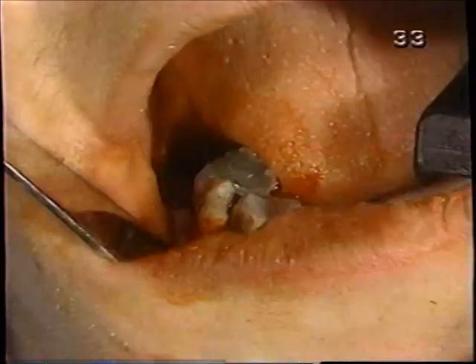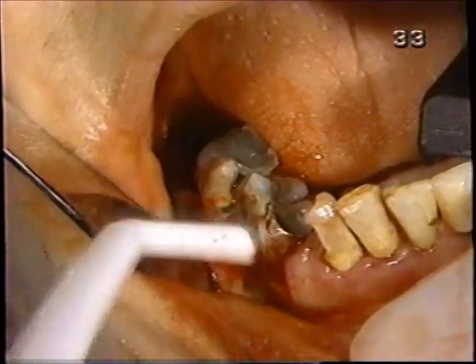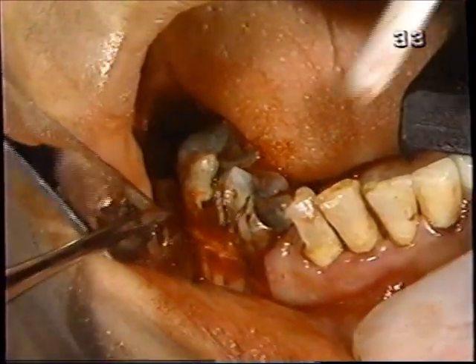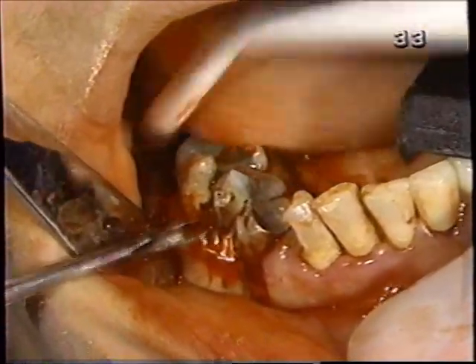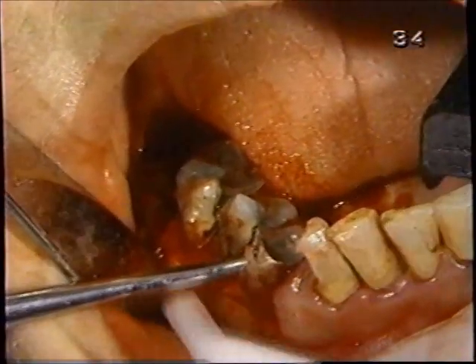One thing that needs to be emphasized, I think, is that you don't spend more than a minute or two on any one thing. That's where people end up spending hours doing an extraction of a tooth. It's where they try the same thing for too long. You need to have a lot of different options and just move on to the next thing and not spin your wheels. Now, this to me looks like a tooth that is just ready to break, Susan.